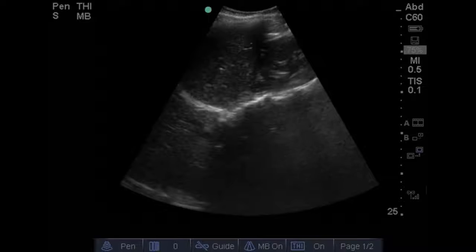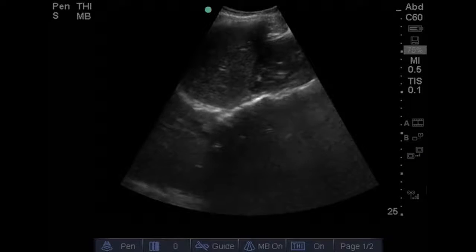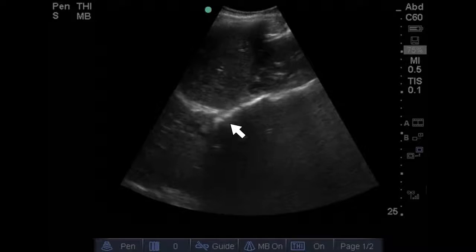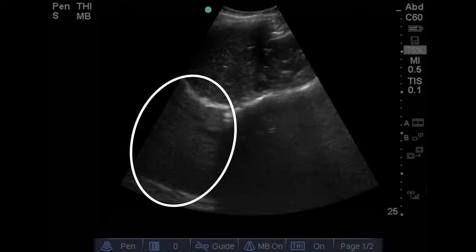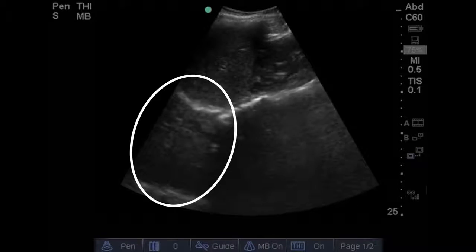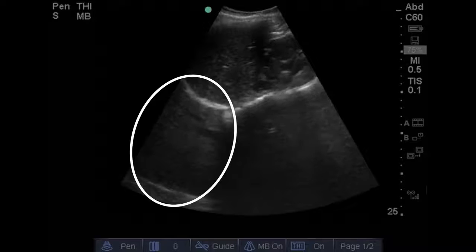And if you look closely, the liver matches on both sides of the diaphragm with hepatic vessels noted on both sides. You can see the spinal stripe stops right at the diaphragm, and we see this area mirroring there, showing what looks like liver above the diaphragm. This tells me that there is aerated lung opposed to the diaphragm, a normal interface.